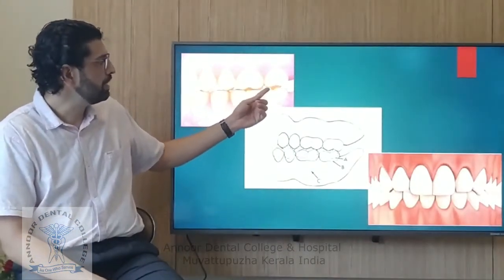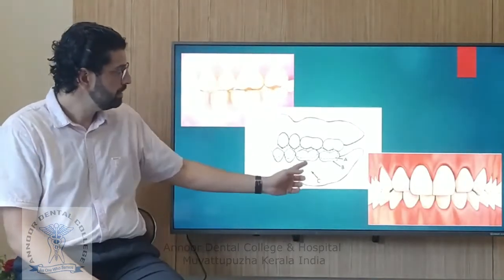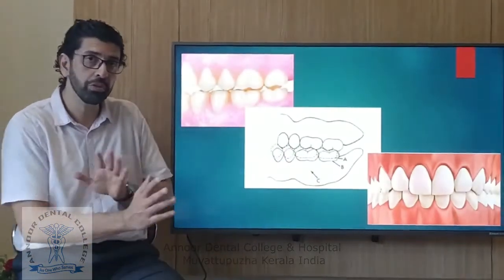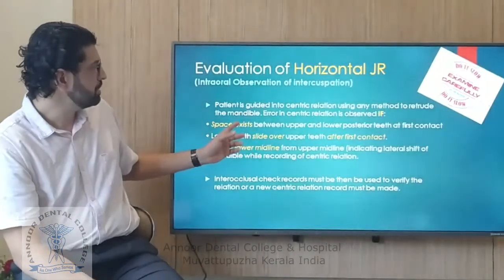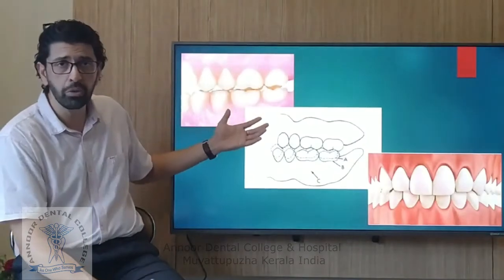The teeth are contacting like this initially, and then they slide. See that? They slide into occlusion. This sliding is not good. You can also have a midline shift that shows a lateral slide. So the three different situations, right? Like I told you before. There's a space between upper and lower, right? And then there's a slide that comes into occlusion, or there's a space continuously.